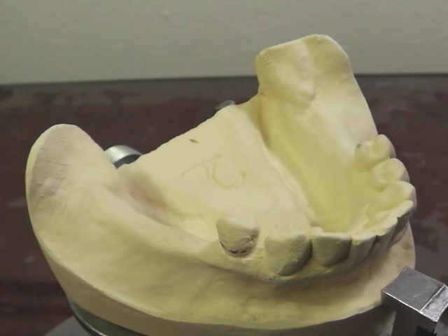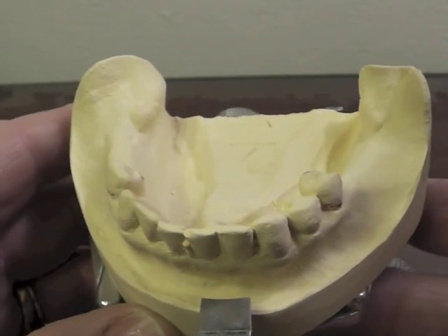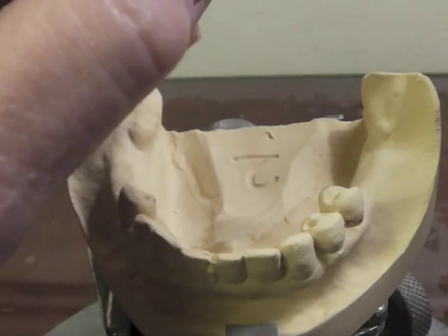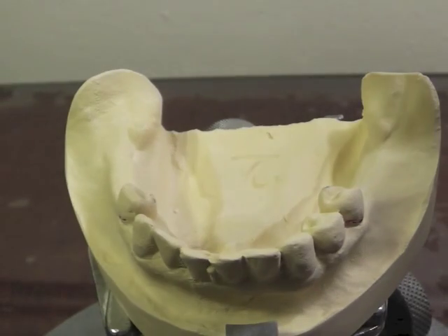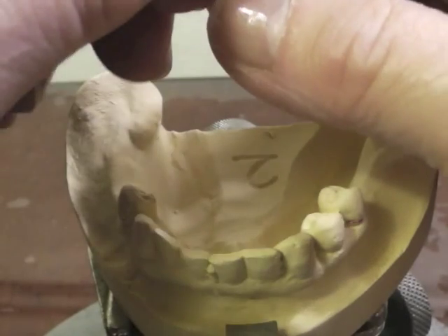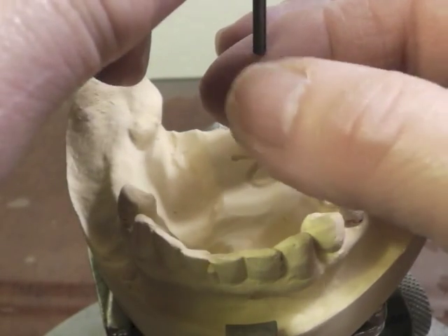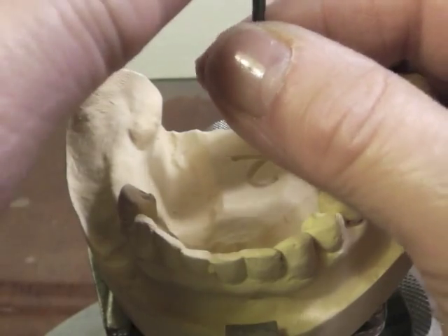I could possibly have a 0.01 mesial facial undercut, but we do not use a cast circumferential clasp on the extension base removable partial denture. I think I have it positioned where I like it, so I'm going to go ahead and survey my cast. I'm thinking in terms of eye bars because that is the clasp of choice, and if I have that indication, it's expected that you use that.